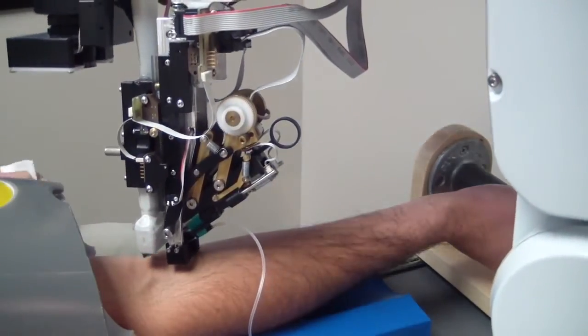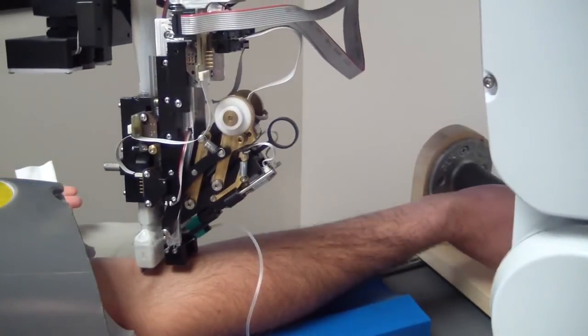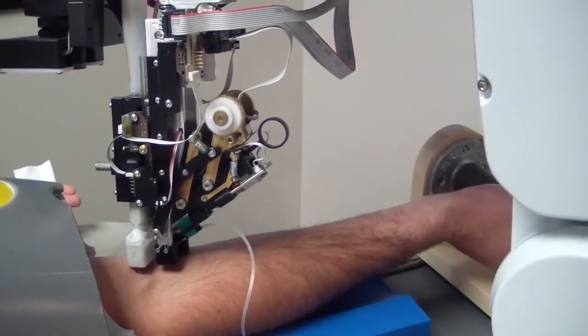But if you've ever gotten blood drawn and had the technician fail to stick a useful vein the first time, a robot that gets it right every time may be appealing. Mistakes are painful. They also waste time, and time is money in a busy hospital.